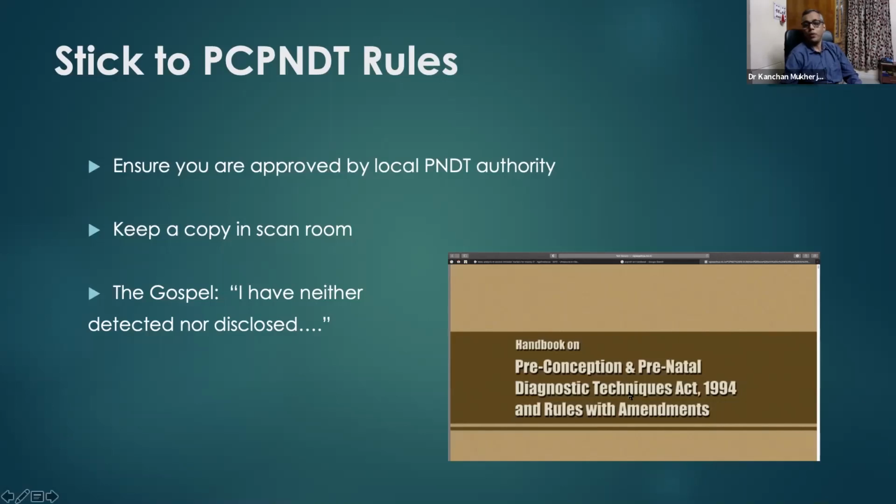Now, those of you who haven't read this handbook on PCPNDT must do so before going ahead, and preferably keep a copy of this in the room. And you must have seen the gospel statement at the end of almost all obstetric ultrasonography reports that I have neither detected nor disclosed the fetal gender. So you should include this. So that's all about the legal part of it, the PNDT part of it.